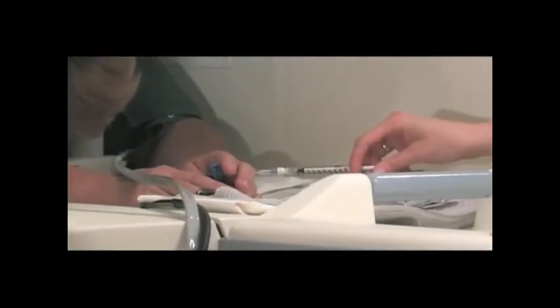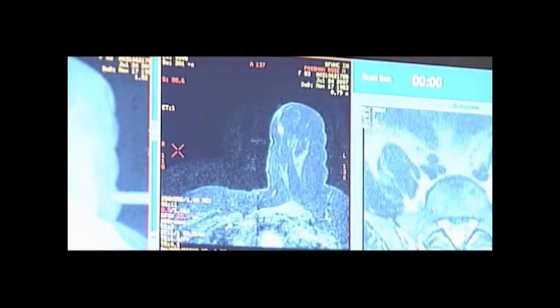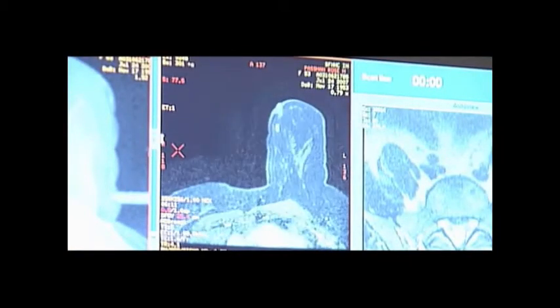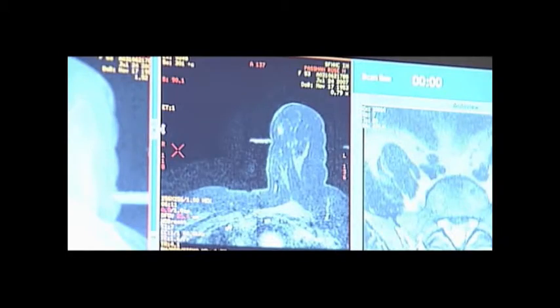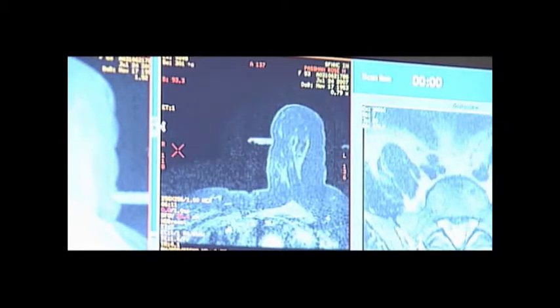Administer contrast agent and start the recommended scanning sequences. The manual targeting method will only require an axial sequence of images. To determine the lesion location coordinates using manual calculations, use the fiducial as a reference point.